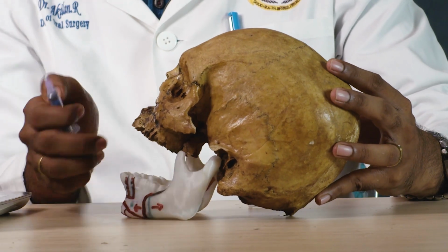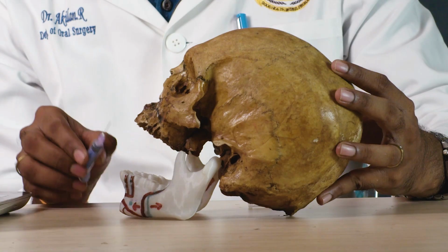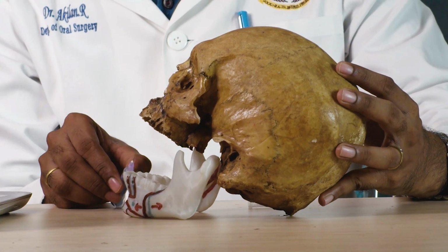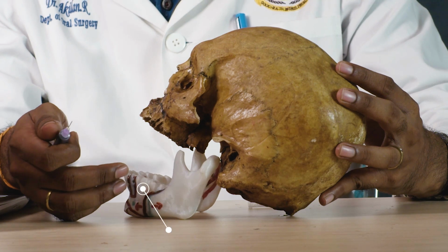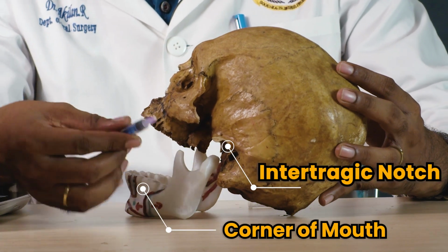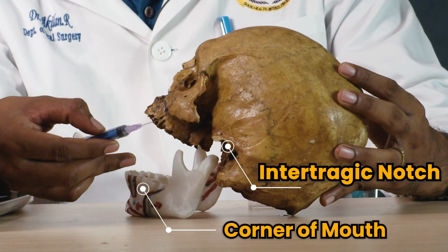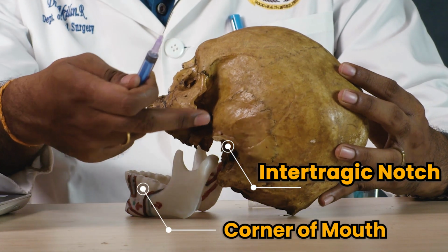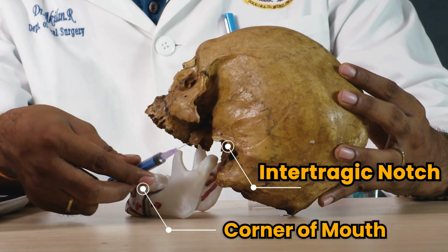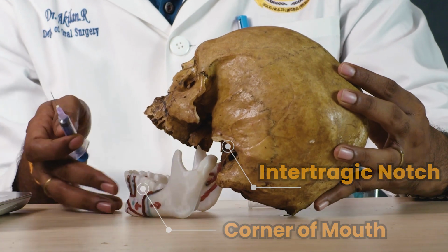So, asking the patient to open the mouth as wide as possible, we have to take our needle, a long dental needle, orienting to a plane parallel to an imaginary plane formed by corner of mouth and the intertragic notch, which will be approximately in this orientation. So, corner of mouth will be present here and the intertragic notch present here, which you can refer from the figure. The needle orientation will be parallel to this imaginary plane.